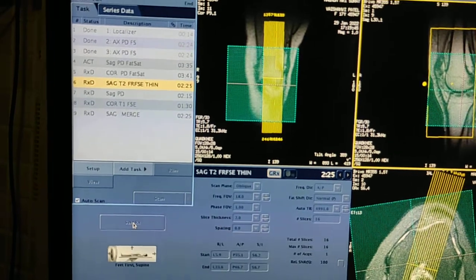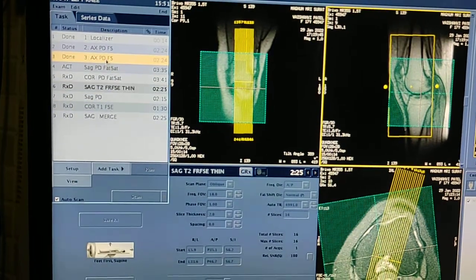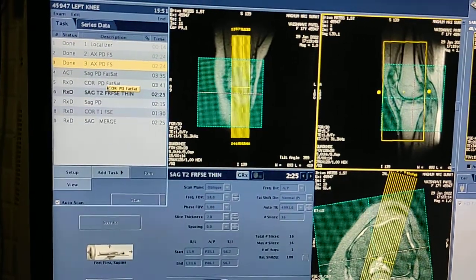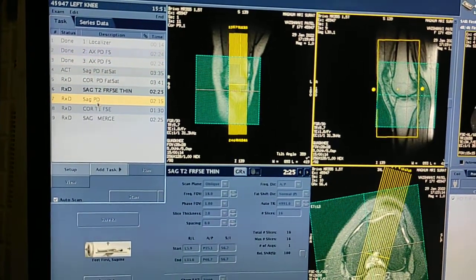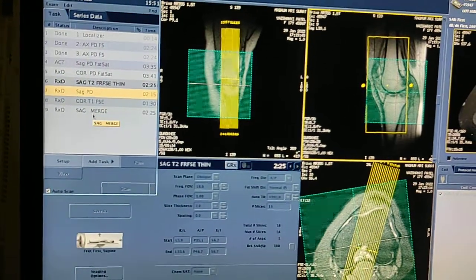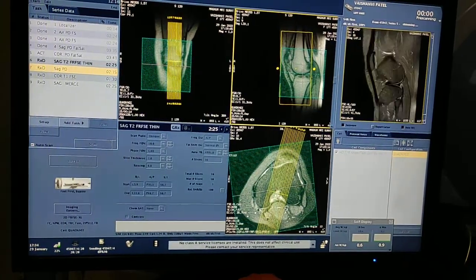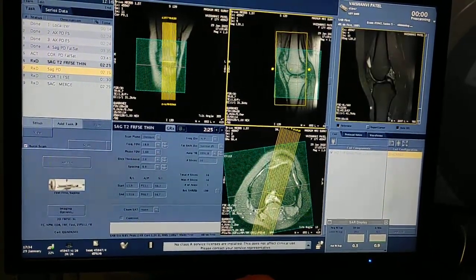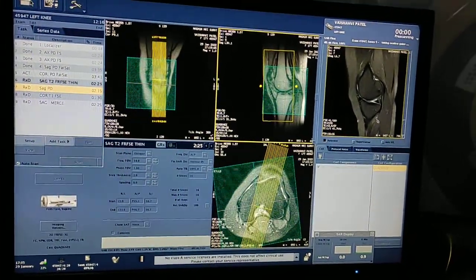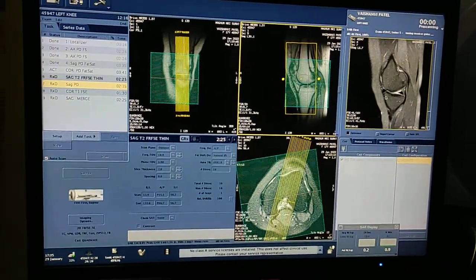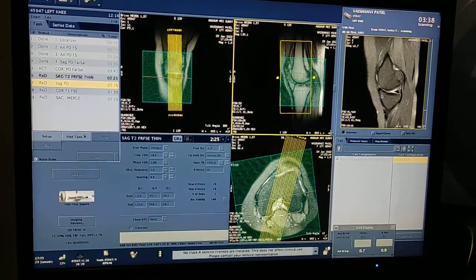This is how you plan all the sequences. The full protocol is: axial fat sat PD, sagittal fat sat PD, coronal fat sat PD, sagittal T2 thin for ACL and PCL, sagittal PD without fat sat, coronal T1, and sagittal gradient. This is the standard protocol. If your consultant wants any other sequence, you can ask them. Sagittal fat sat PD is also ready.